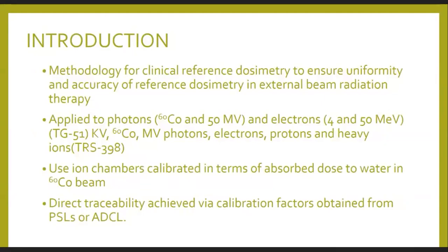And the measurements are directly traceable to, or by calibration factors obtained from, primary standard labs or accredited calibration labs.